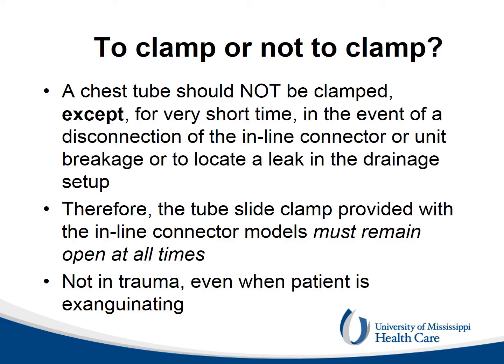Furthermore, accumulation of undrained air in the pleural space will detach progressively more lung from the chest wall, making futile the previous attempt to eliminate the pleural space.